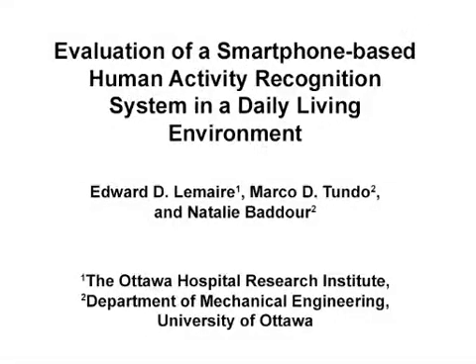The overall goal of this activity recognition methodology is to provide a standardized evaluation method for testing wearable mobility monitoring systems by including continuous activities in a realistic daily living environment.